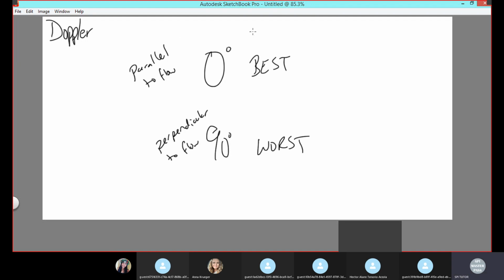But when you are doing 2D imaging, not Doppler, just your regular grayscale 2D imaging, you actually want this, 90 degrees. So when you're in Doppler, you want to be going with the flow. When you are in 2D imaging, you want to strike your tissue at a 90-degree angle. So your tissue is like this, and you're striking your beam straight down, and that creates 90 degrees. Because it offers normal incidence, so a stronger reflection. And because we're looking at imaging, we want stronger reflections.